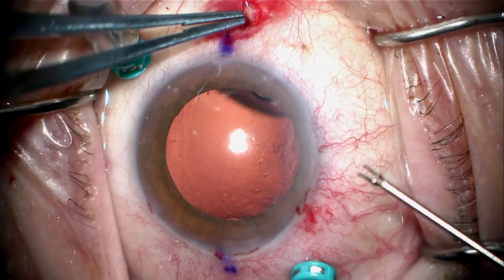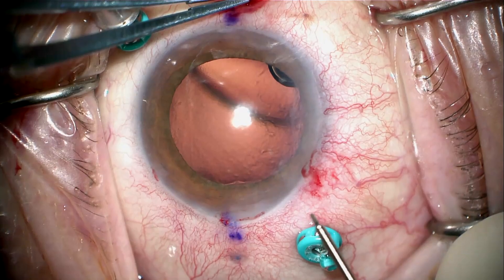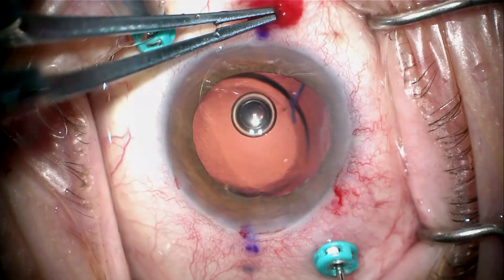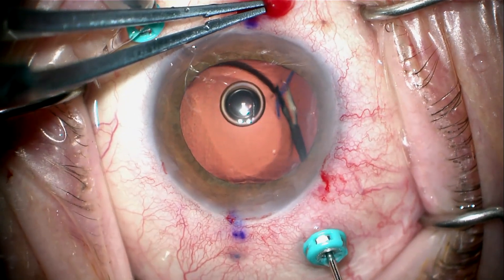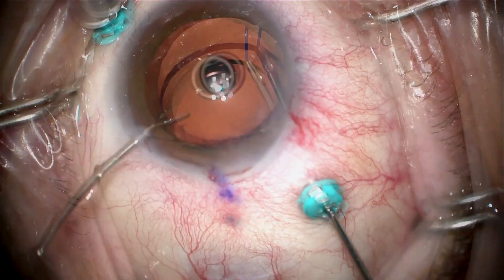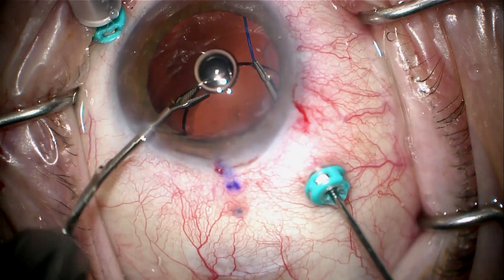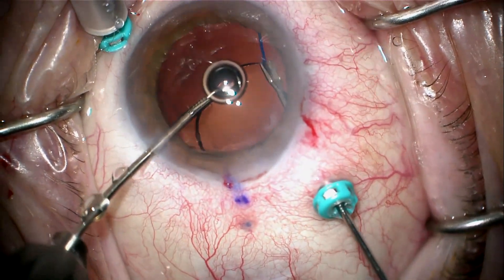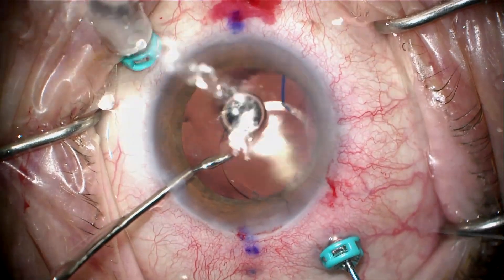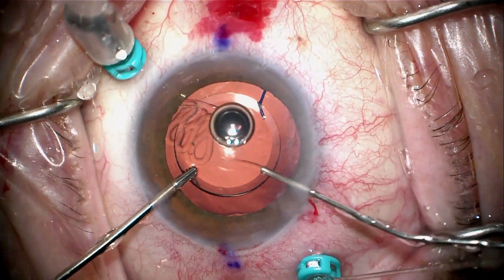The first thing we're going to do is grab this flange that is still inserted and use this to rotate the lens into position where I can secure the haptic-optic junction with my micro forceps — a 25-gauge micro forceps that goes through the trocar — and now I have the lens securely.